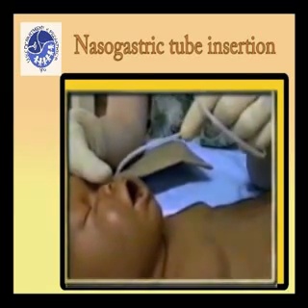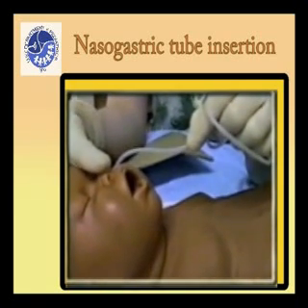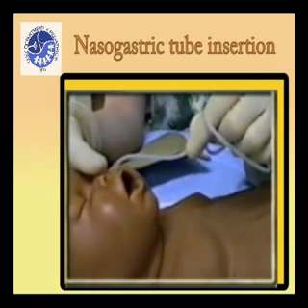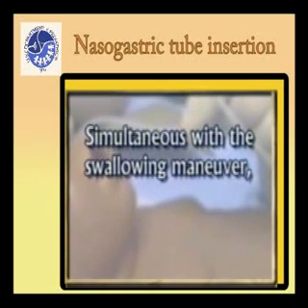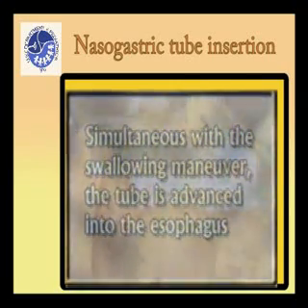Slide the tube into the nostril along the base of the nose, aiming toward the occiput. When the tube reaches the pharynx, ask the patient to swallow or offer him water to drink with a straw. Simultaneous with the swallowing maneuver, the tube is advanced into the esophagus. The tube is inserted to the pre-measured site.